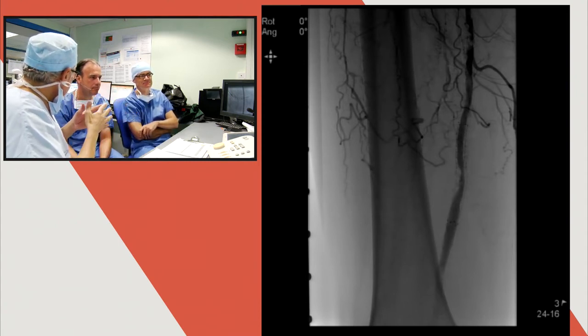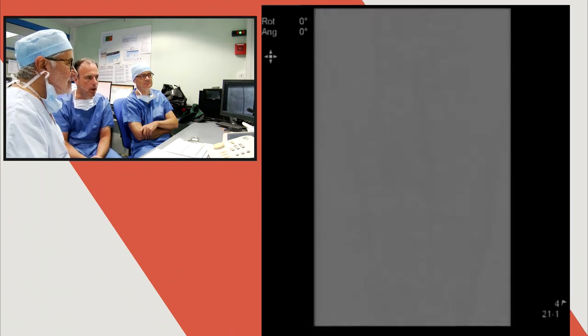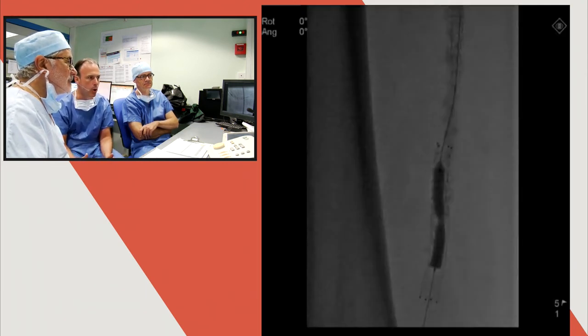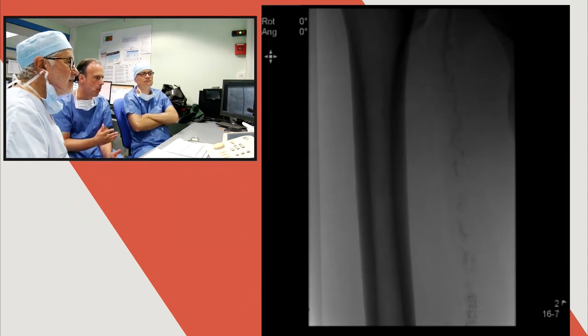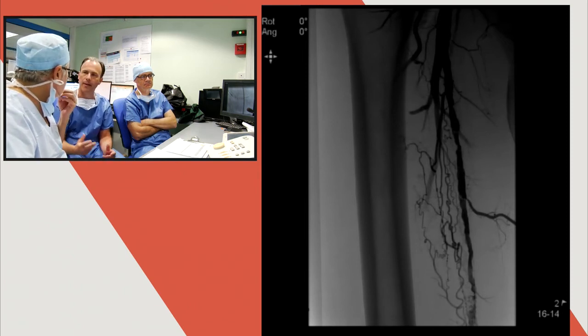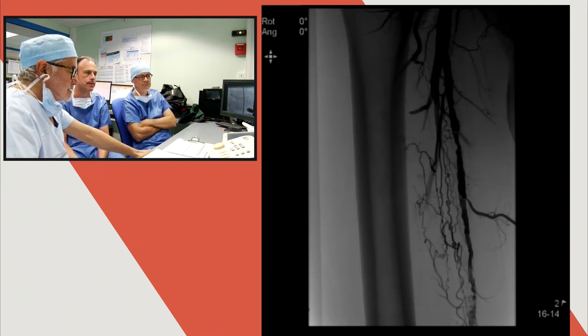So the discussion was whether to use drug-eluting balloon alone. This is a little bit the strategy that we use nowadays in our service. We prepare the vessel as we discussed already, and if we notice that the lesion and the patient is an angioplasty responder, we try to continue, although the vessel is quite calcified, and you can have questions in terms of the efficacy of drug-coated balloon only therapy in these kinds of heavily calcified vessels.